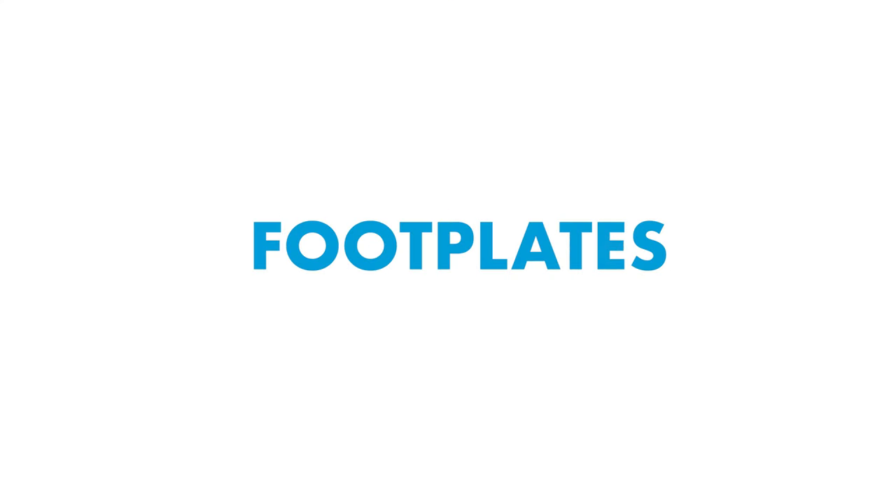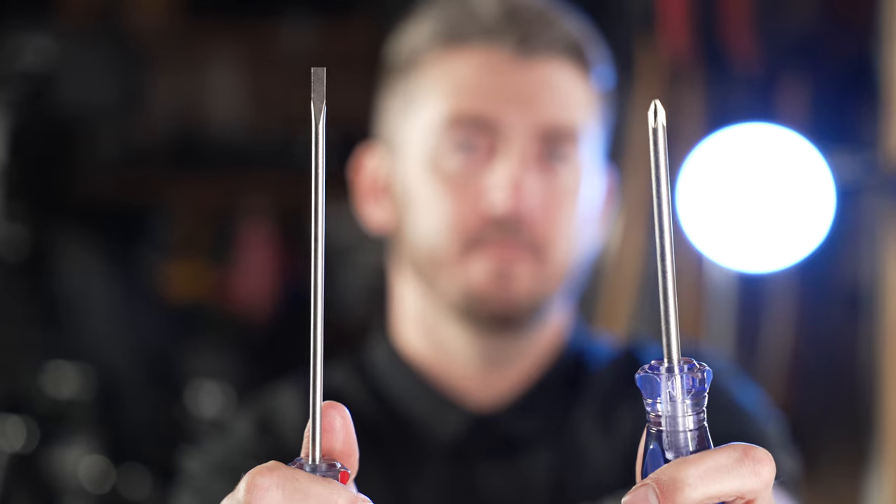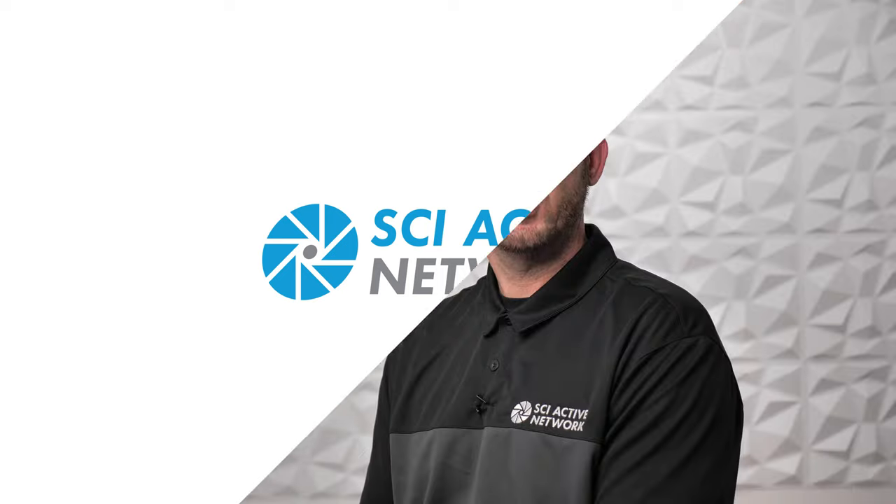Footplates. Tools you'll need are allen wrenches and possibly a screwdriver. There are two types of footplates: swing-away footrests, mostly used on folding wheelchairs, and the more common fixed footplate that may have angle adjustment and/or flip-back features.